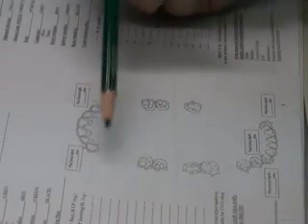Now let's move to our case. First case on the left. Now the cases, one by one, will become more difficult, meaning that I have to think of more than one thing at the same time. Okay? So let's take this one, it is bounded. Let's go back to the basic design. What is the basic design?